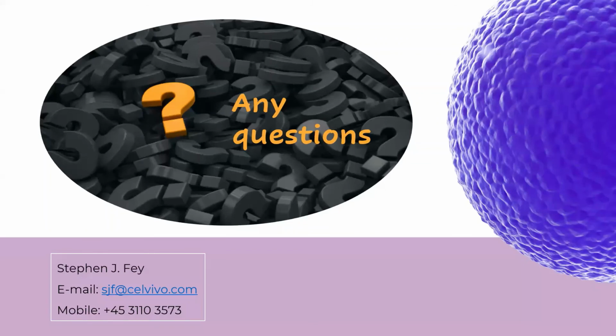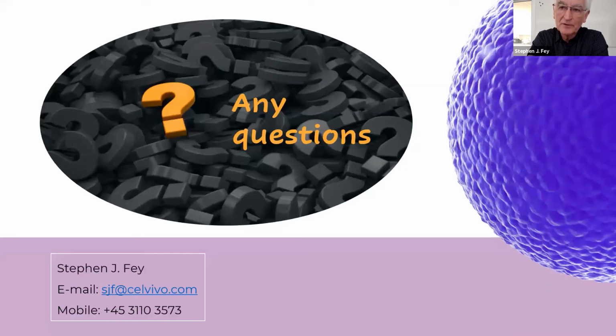Good, thanks. Then I have a follow-up question. Any particular recommendations when working with primary cells to develop organoids? There, I think no particular recommendation, because it'll depend on the cell type. But I think your benchmarking will become ultra important because primary cells, unfortunately, have a tendency to die. So you need to find the best time with which to work with them. Making the alginate spheroids could give you a kickstart because you produce the alginate spheroids very quickly, and maybe then you can work faster. You could save a few days that way.